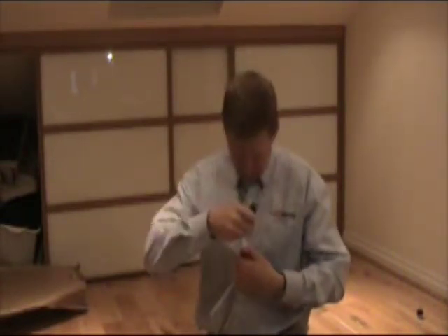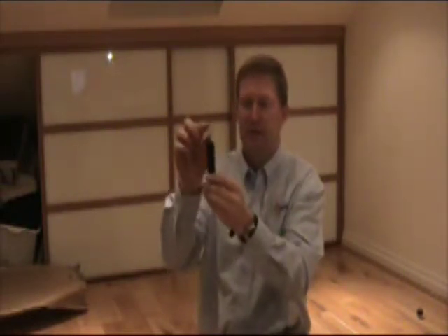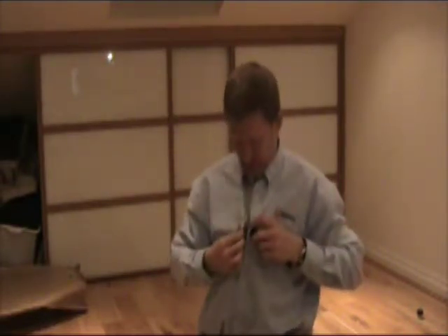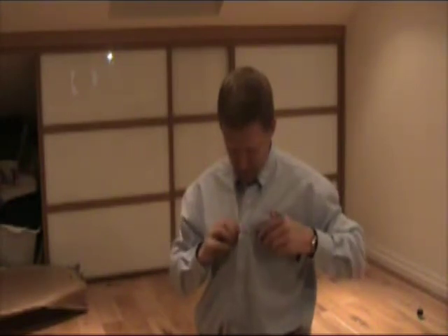Basically how it's used is, say on my shirt, I've got a small button so I use the small button aid. It's made of plastic and it's got a little strong wire mechanism at the front in a diamond shape. So you push it through the hole in your shirt, put the button in the button aid — the catches on the end — just pull it through and then unhook the button.